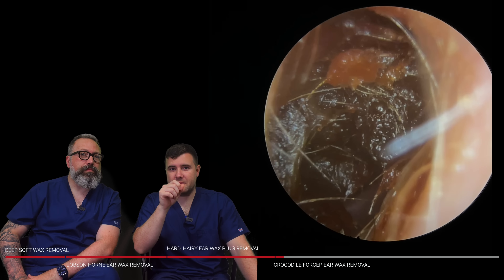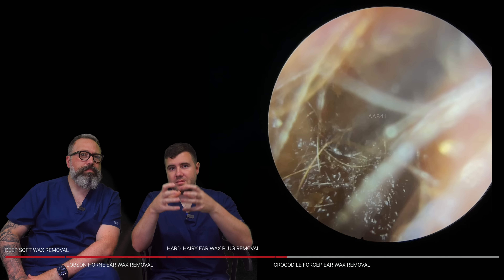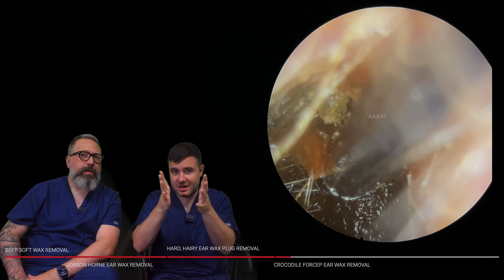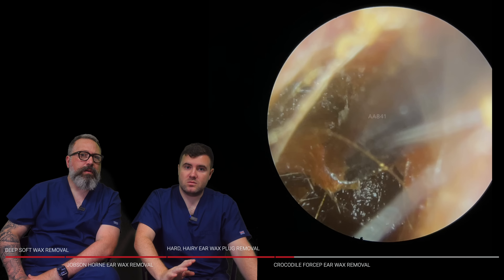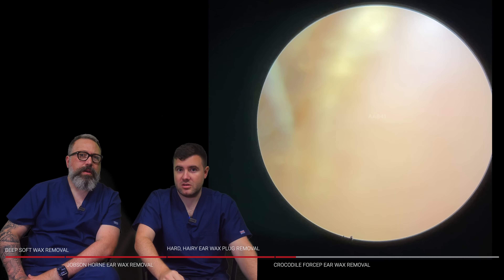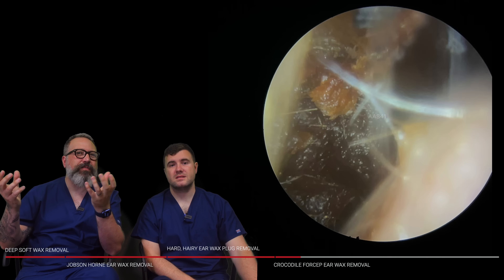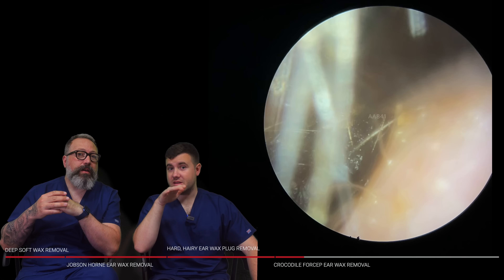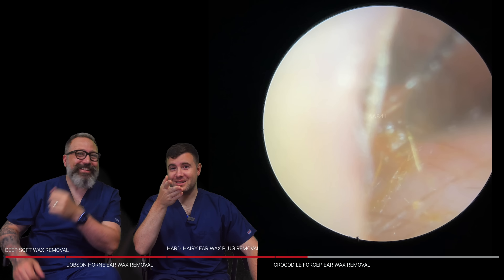A little bit of a flinch there. Sometimes patients, especially when they've got this hairy wax, it's more likely to prompt that Arnold's reflex — so they're more likely to give us a bit of a cough, which I think is probably what that was. Sometimes as well, patients tend to feel it when the wax is quite stuck to the ear canal. So even if it's quite dry wax, when you're lifting and peeling it away, sometimes as it suddenly detaches off the ear canal, some patients will feel that resistance — like a little pull.